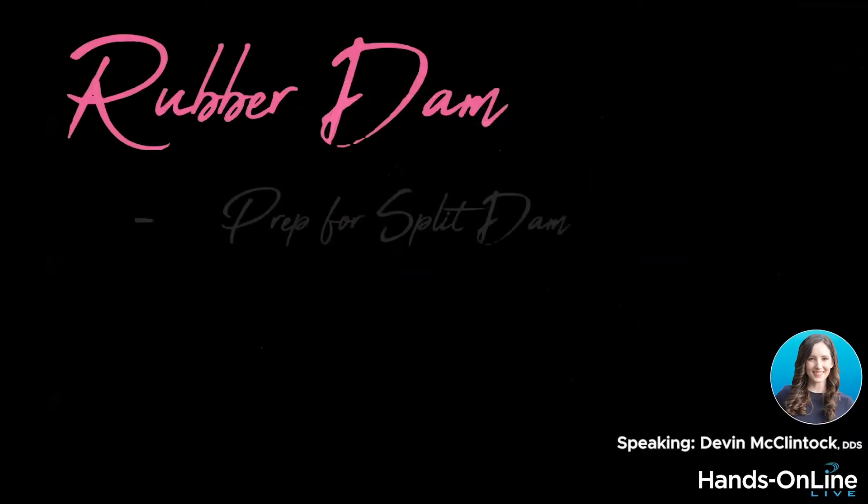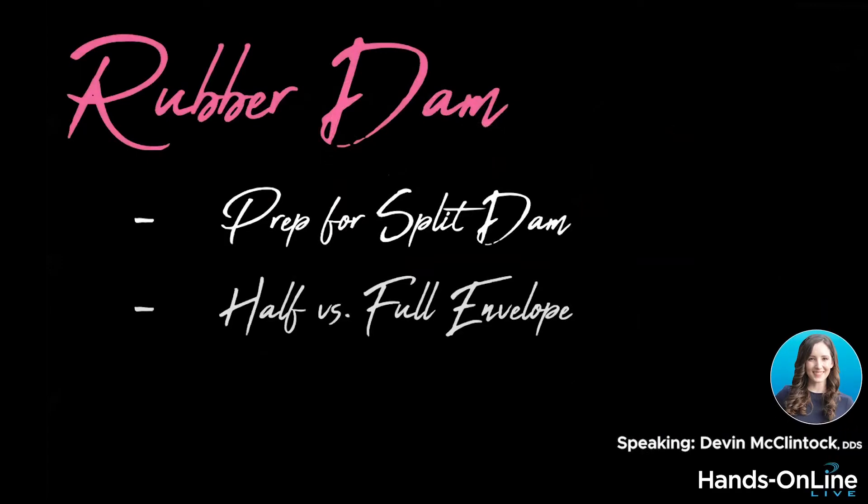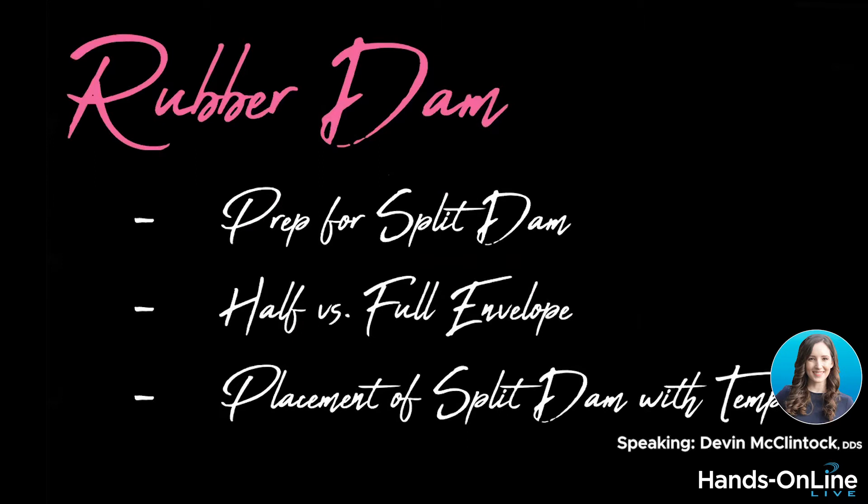We're going to do two hands-on demonstrations. First is the rubber dam. I'm going to show you how I prep for the split dam, how to fold it into the half and the full envelope, and then how to do the split dam and seal it with the template.